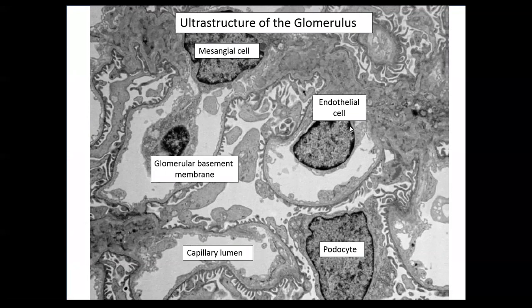And endothelial cells should be at the base. They sit on top of the mesangial matrix. They are in direct connection with the mesangium. And what happens is the GBM actually comes along here from this capillary loop. So here's your capillary loop GBM, and it reflects and goes along the mesangium. So this region that's lining mesangium is called paramesangial glomerular basement membrane. So this endothelial cell sits directly on the mesangium, and then the mesangium is also in direct contact with GBM at certain regions, okay?